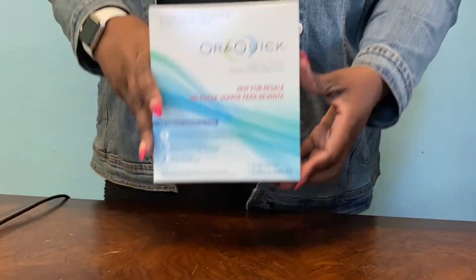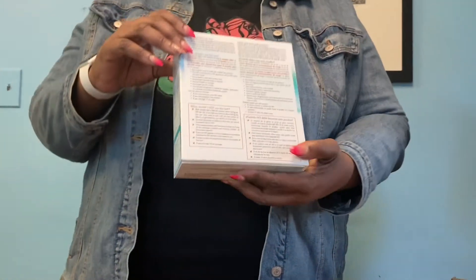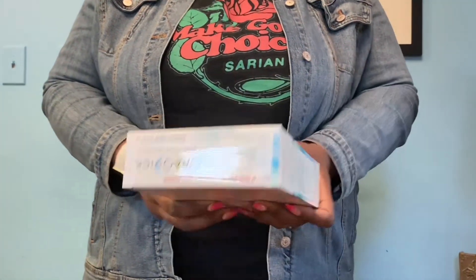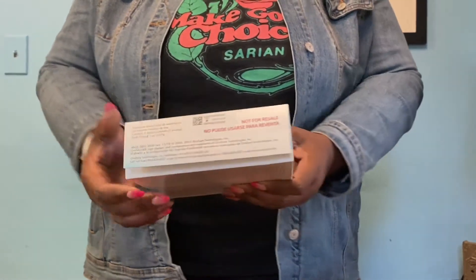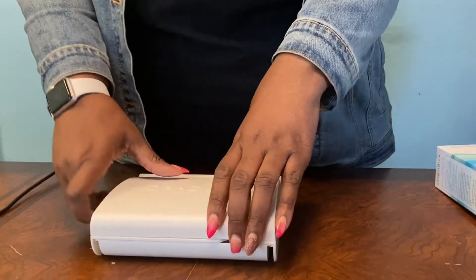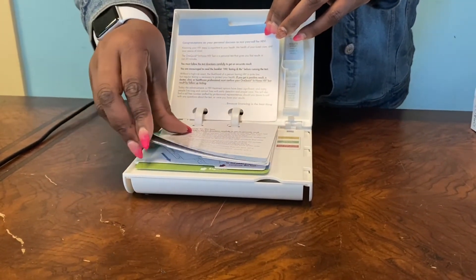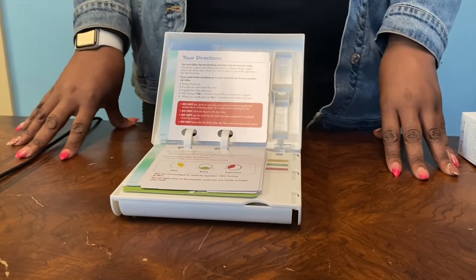This is your test kit. Make sure you write the information on the back of the box. Check the tamper evidence seal and the expiration date. Open it up. Inside are step-by-step directions. Follow them carefully to be sure your results are correct and give the testing process your undivided attention.